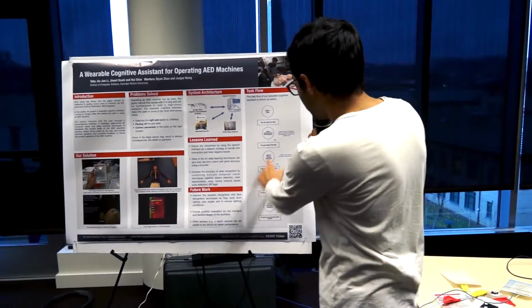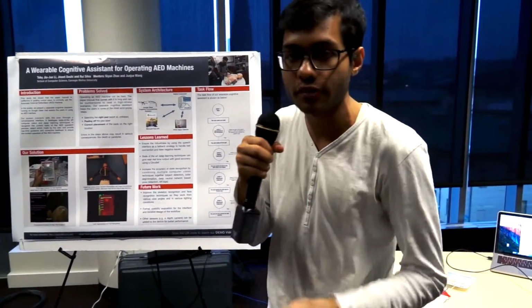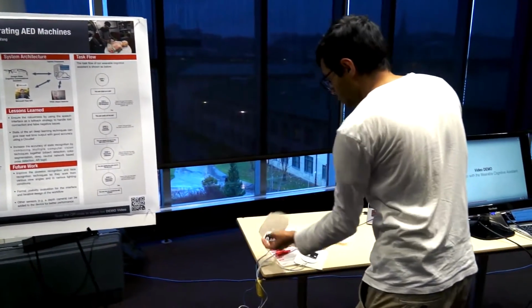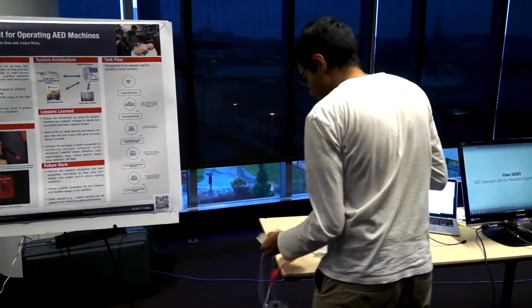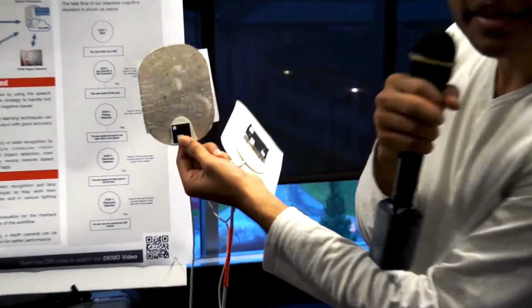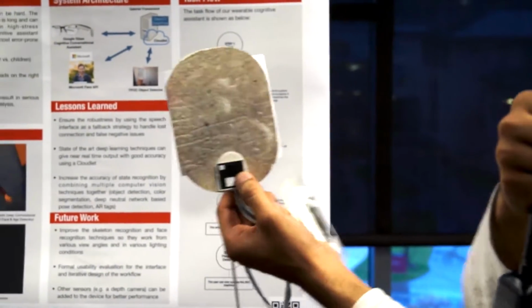After that, we move on to the peeling off problem, wherein the user forgets to peel off the pads. There, we ask the user to peel off the pads, and the peeled off pads basically have these AR tags on them. We detect this AR tag on the pads, which shows that they have been peeled off now.